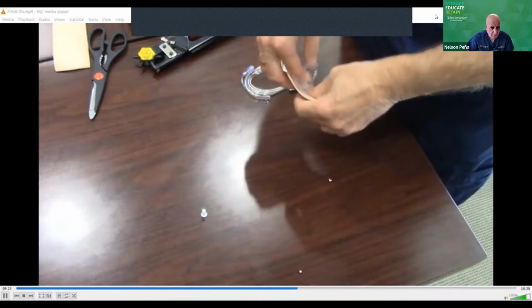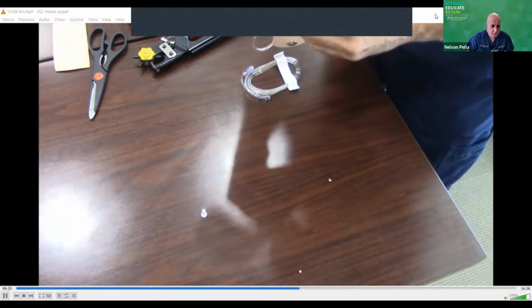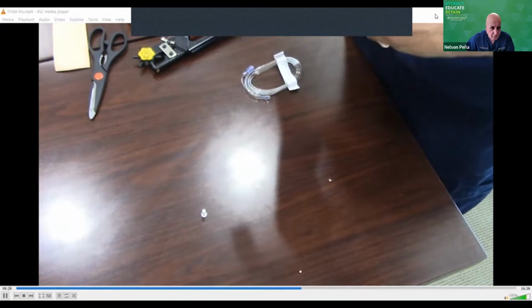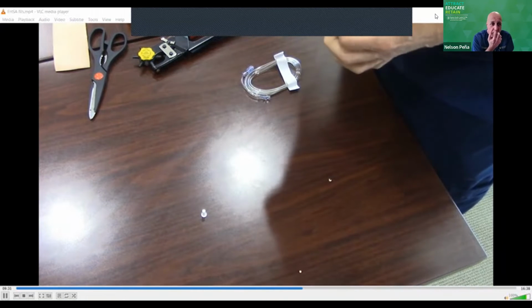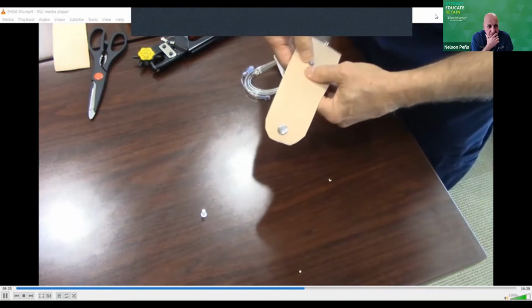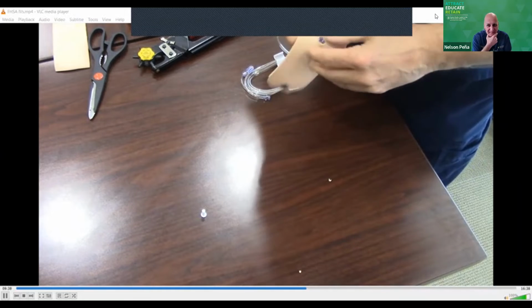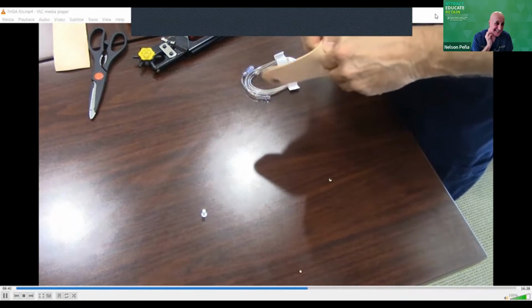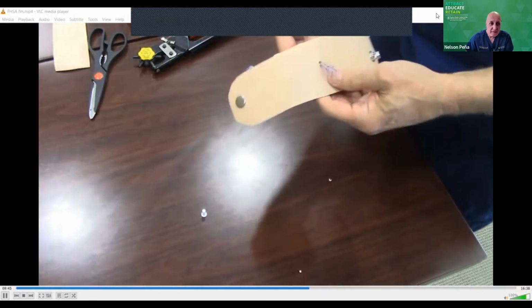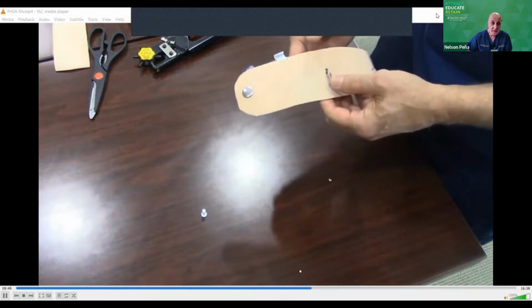Let me unsnap it so you can see what I'm doing. So I'm basically forcing it through to the other side. And since it's plastic, it's pretty flexible. You notice how easy it is to do. There. Once you get that piece through there, then it becomes easy. Now, you've got it finished, for the most part, of what you wanted to accomplish.